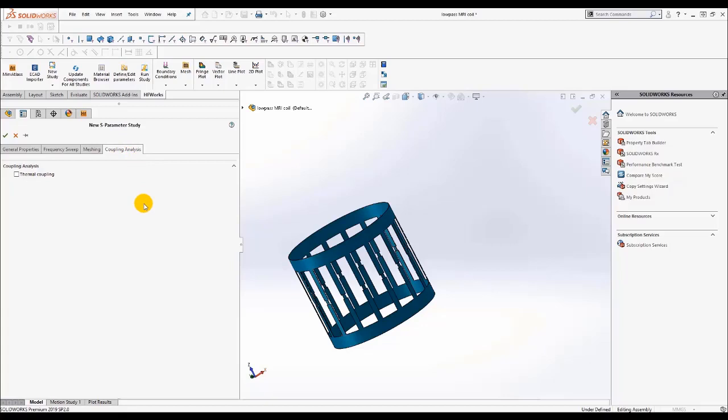As we said, HFWorks enables the electrothermal analysis with steady state and transient thermals. So if you want to add a thermal analysis, you have to check this one, and you validate. So a new study will be created.